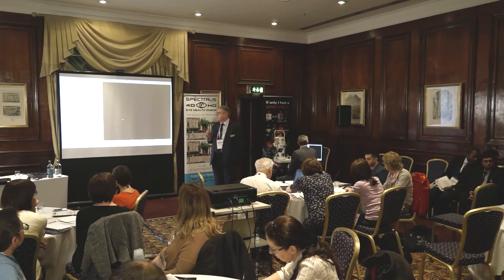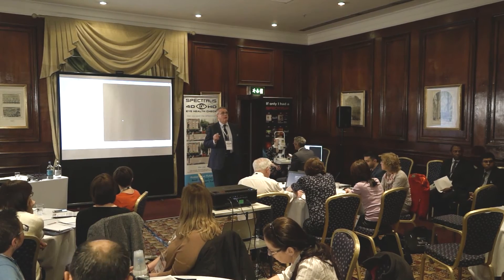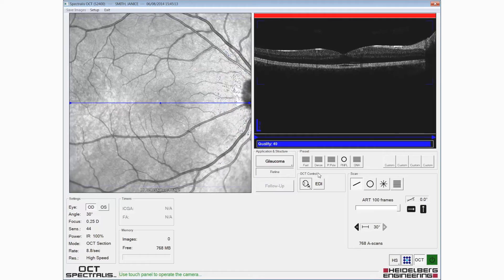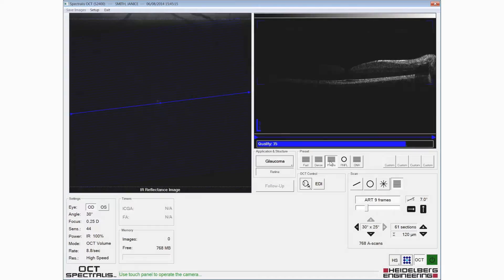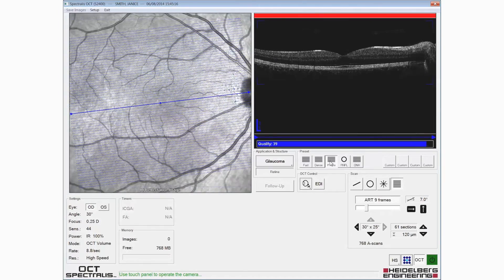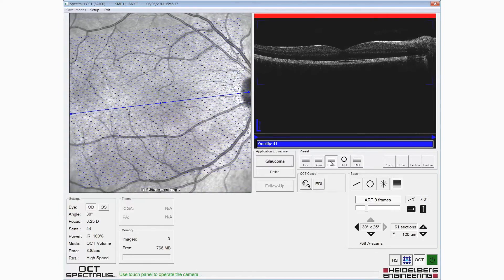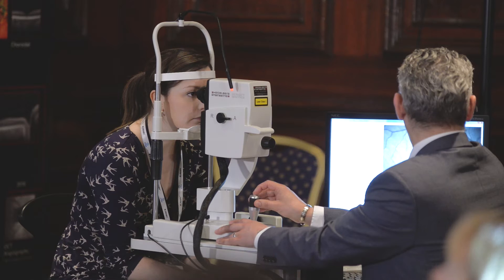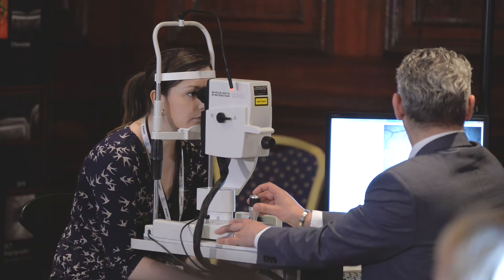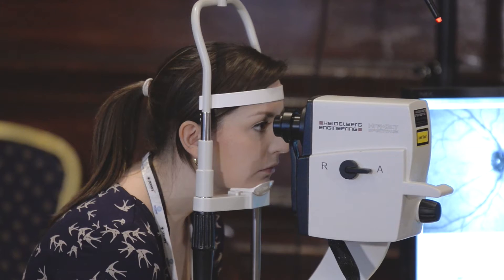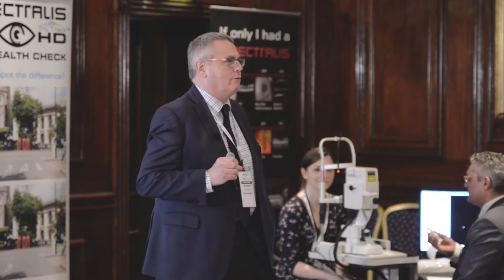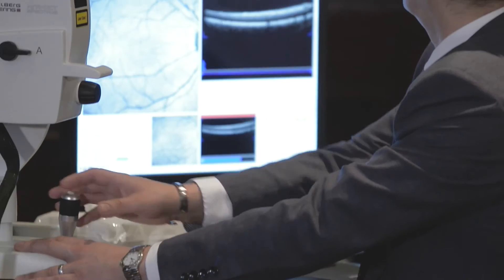Before we start that, I think it's important that we identify what is normal. And we're starting out evaluating Emily's eye. Emily is a young, healthy subject with no ocular pathology that we're aware of. And we'll have a quick look and quickly assess her eye.